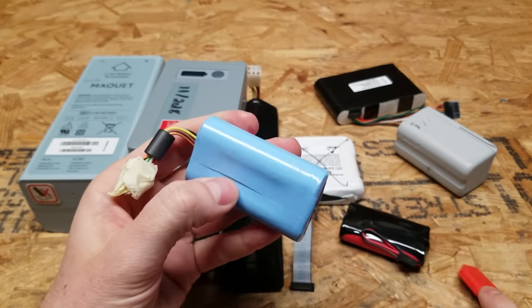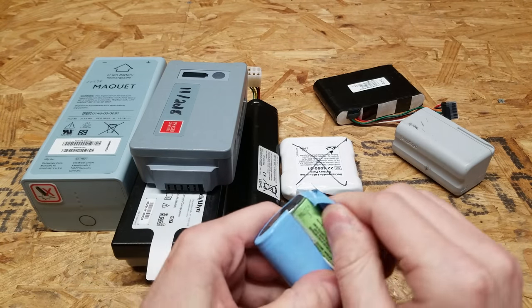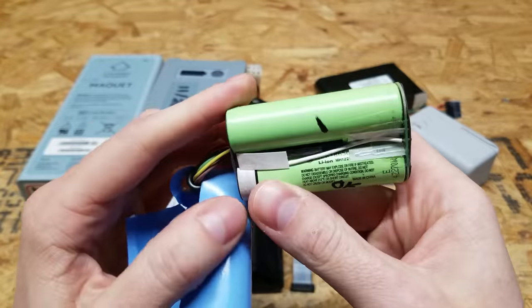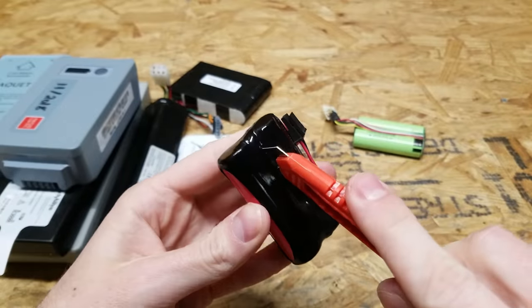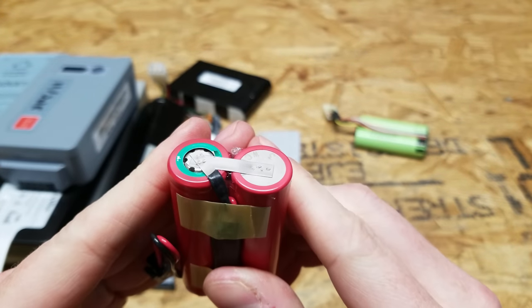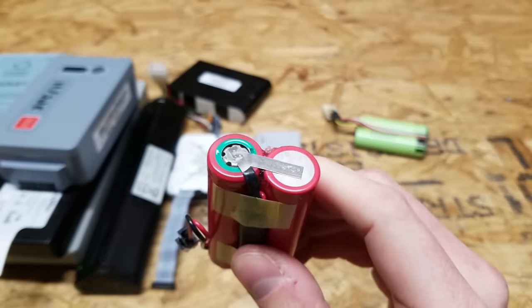I want to very carefully slice, because if there are pouch cells in here you don't want to accidentally slice through them. We've got some Panasonic NCR18650B — these are fantastic cells. And we already know that these are Sanyo's, but let's open it up anyway. They are the green rings. Their average performance in my testing — they're not the purple rings, which are probably the worst of the Sanyo's — so these are fairly good.